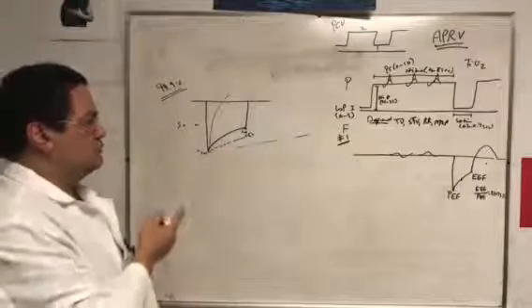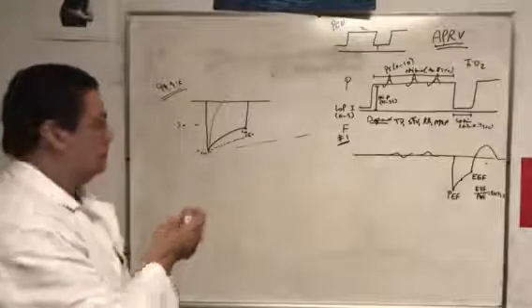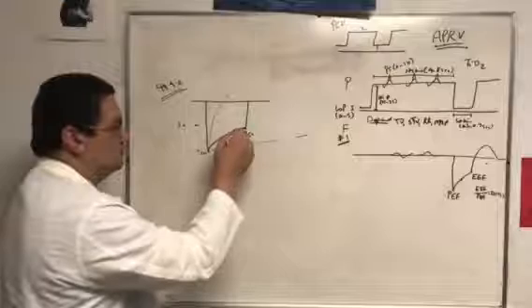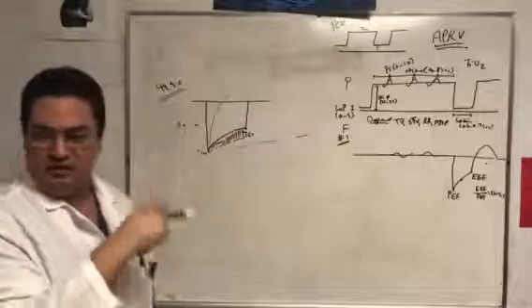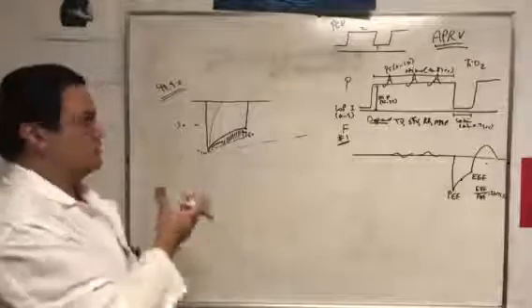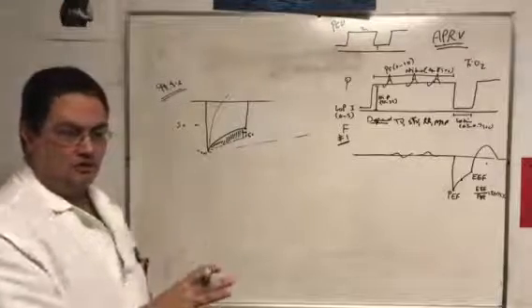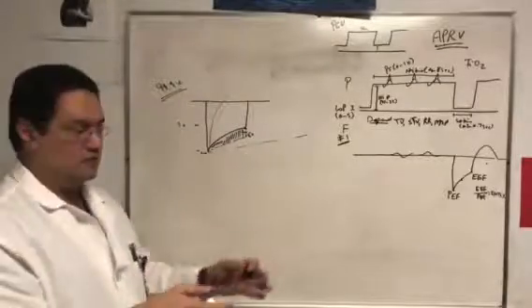How do you know that this wave is improvement? Because of this. This area here is an additional area under the curve, which means that the tidal volume had improved with the same settings. I didn't change the settings at all. Same time, same pressure, same everything. And it was 50% and now 60%.